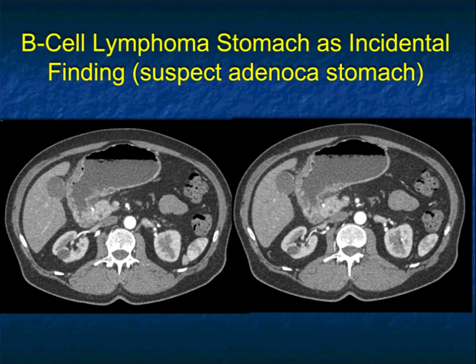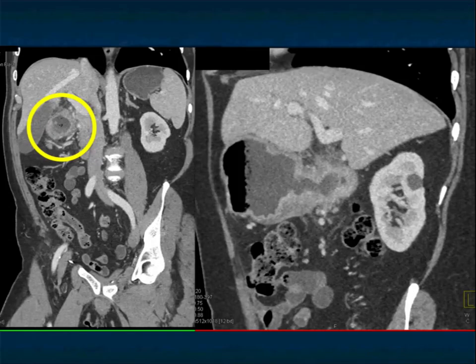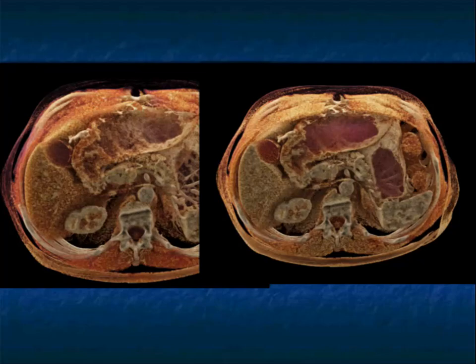Here's a patient with abdominal pain. I thought this was an adenocarcinoma — infiltration of the antrum possibly going into the duodenum. The involvement potentially of the duodenum should make you think about lymphoma, but that was kind of borderline. This really looked like primary cancer of the stomach, with at best minimal adenopathy. Here it is in the coronal view — very much looks like the adenocarcinoma I showed you before. But this was lymphoma.